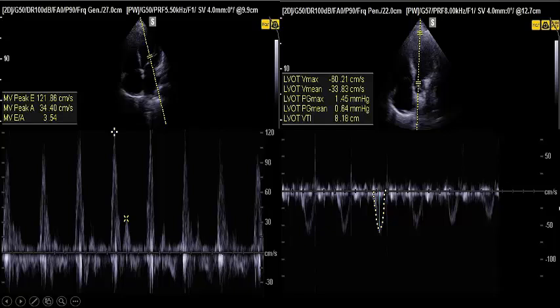Really, there is a very important point here also. With this type of severe left ventricular dysfunction and very bad stroke volume, I would expect the heart rate to increase to compensate and increase cardiac output. But unfortunately, our patient has been on a beta blocker. You should consider this in diagnosing your patient.